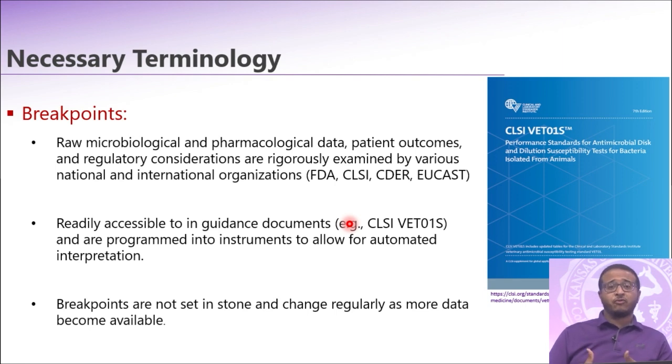So for example, here for us in the United States, these breakpoints are reviewed either by the FDA or the CLSI, the Clinical Laboratory Standards Institute, the Center for Drug Evaluation and Research, and in Europe by the European Committee of Antimicrobial Susceptibility Testing.